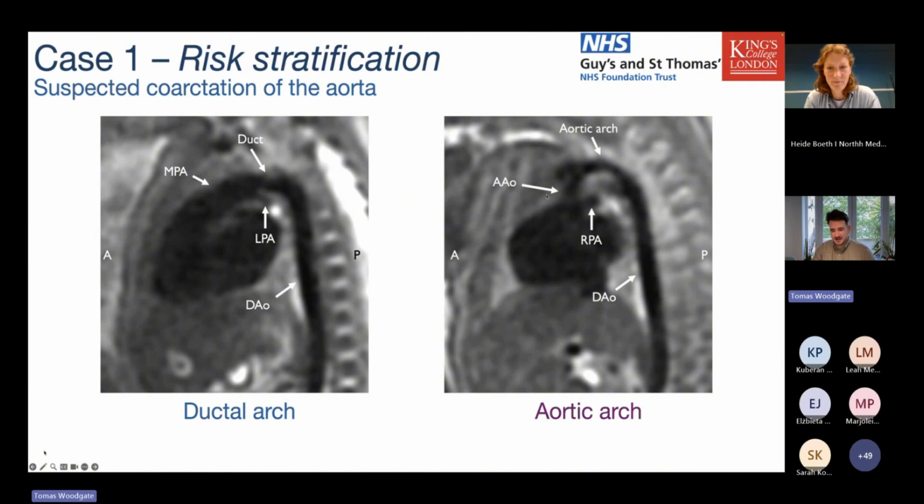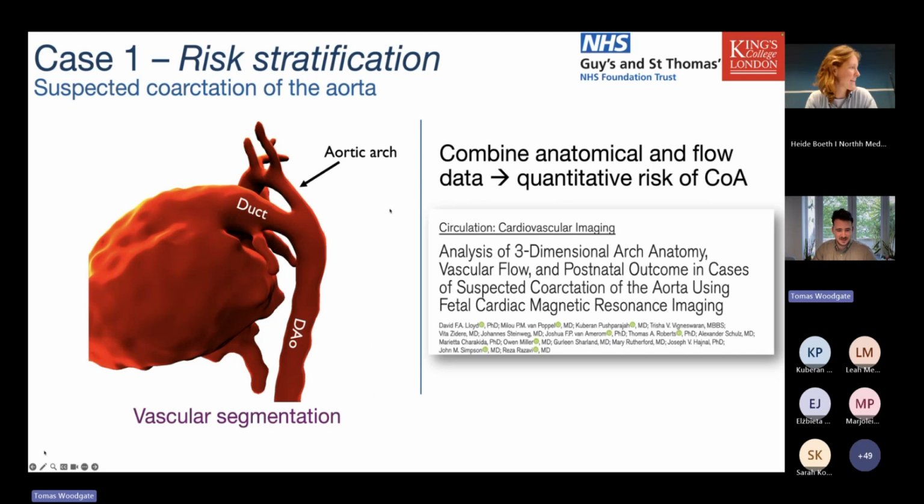Here you can see the ascending aorta, and in this case it continues, and it is narrow, but it has this nice confluent contour, and continues on with the descending aorta back here. We can see that in 3D again, and this is the type of morphology of the arch where you definitely have this arterial disproportion, but you're not seeing significant displacement of this aortic isthmus. You've still got this nice contour between it and the descending aorta.